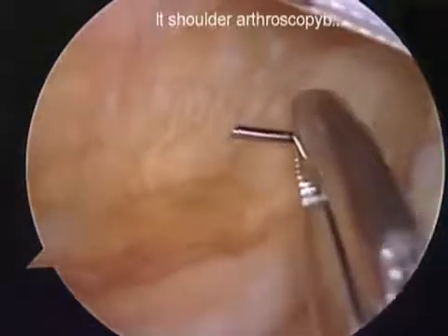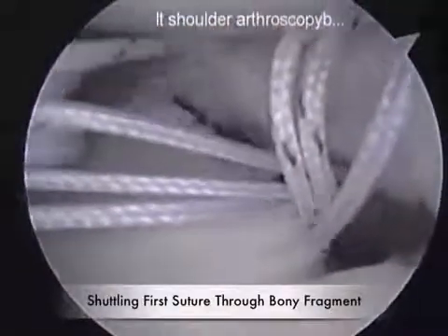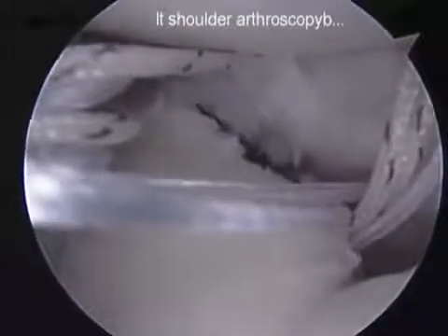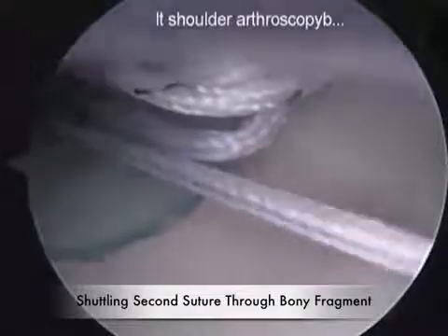The spinal needle is removed, and the nitinol wire is used to shuttle the first suture through the bony fragment. These same steps are repeated for the second suture, and the two sutures are now in position to secure the bony fragment. Due to the small size of the bony fragment, we elected to remove the second suture from the anchor prior to tying.